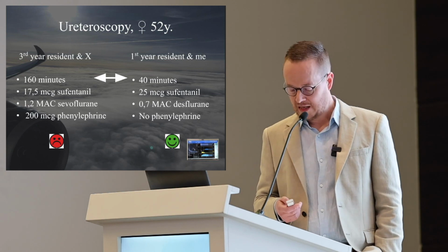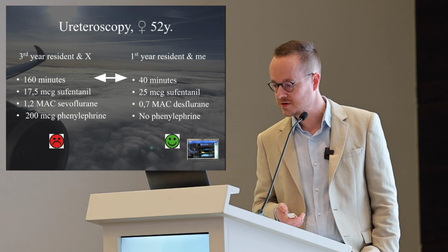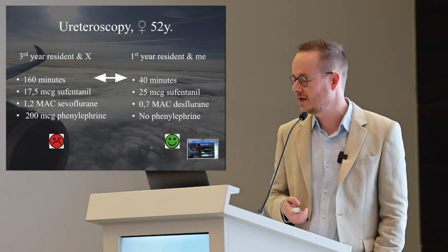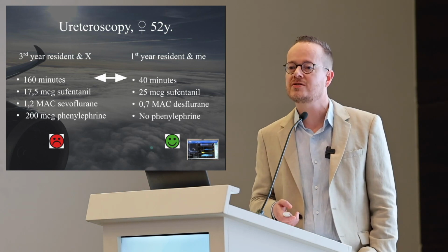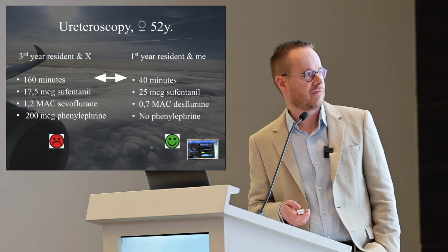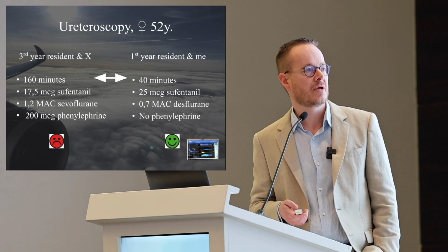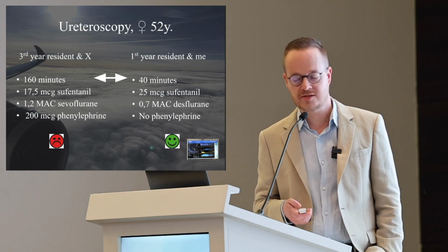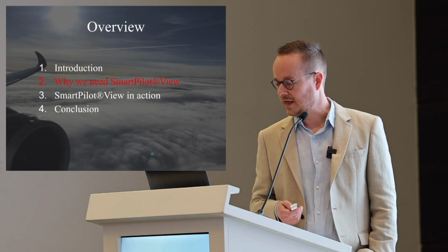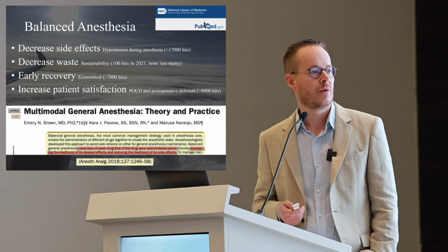So that's why I went to review both files. This is what it shows. So there's of course a difference in the duration of the operation, but that's not in our hands. Otherwise, there's also a few other differences. So I gave a little bit more opioids, and I gave a whole lot less of inhaled anesthetic. And there's something else. I used a device called SmartPilot View.